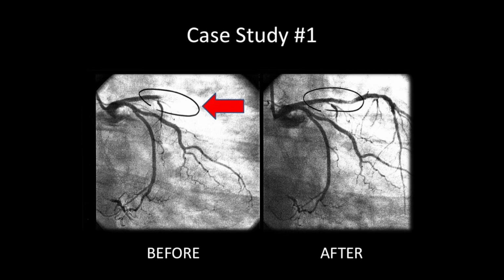So I'm shooting a movie, but I'm using a camera that actually emits x-rays, with a sensor or whatever to do the x-ray. And so when you look at this, this should have continued down here like it does here. So she has an occlusion here, okay? And I believe, Tom, this should be LAD? I think it's either LAD or the circumflex. Okay. No, I think it's the LAD. So again, it doesn't matter, not important, right? It was lateral, so it should have been right, but it doesn't matter. So, okay, she has an occlusion here.